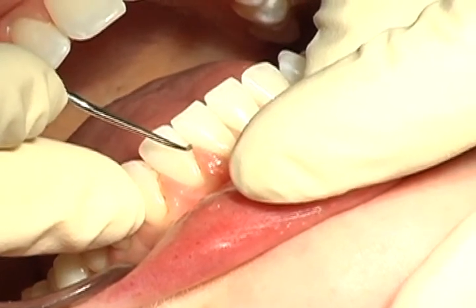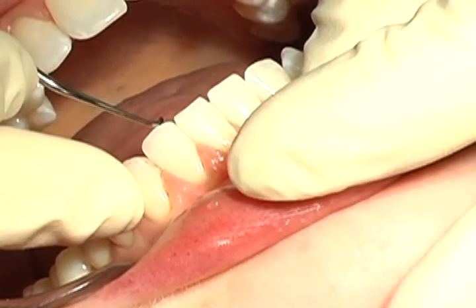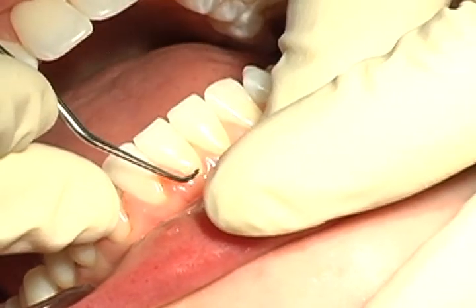The Micro Mini 5 1-2 adapts well to the narrow root anatomy of anterior teeth while reducing traumatic tissue distension.